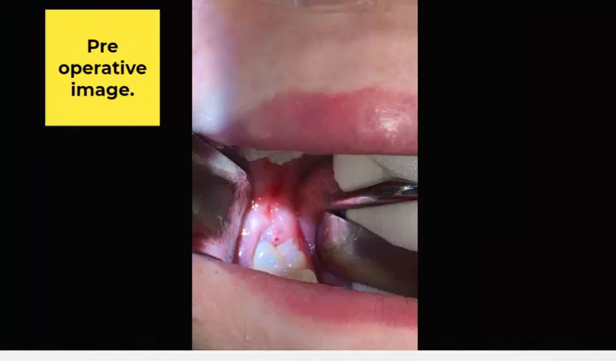This is the preoperative image focused on number 32. I will look initially at the second molar, tooth number 31 in this case. My whole flap design is an envelope flap. Let me tell you a little bit about how I learned this — it's a simple concept in my mind. My mentors that I trained under simplified it.